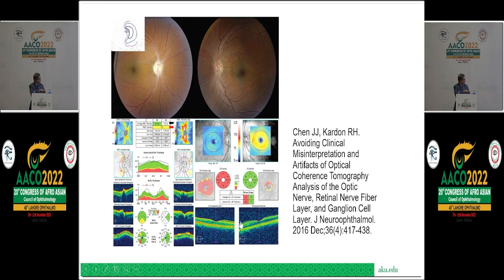But when you plot it and you look at the loss, it still shows within the green. But the key thing to keep in mind, if you just look at this, you would say it's pretty normal. But knowing this and knowing that the other eye is extra thick normally, right? The 30% loss still looks like it's in the normal range, but it actually is a significant loss.